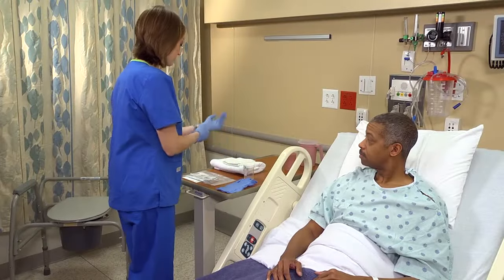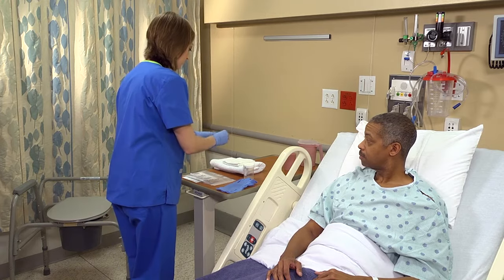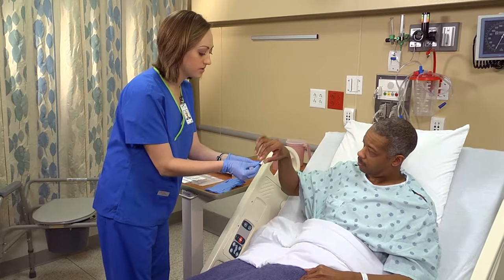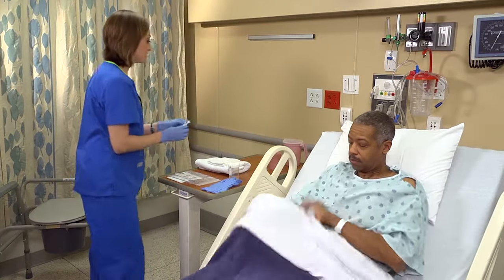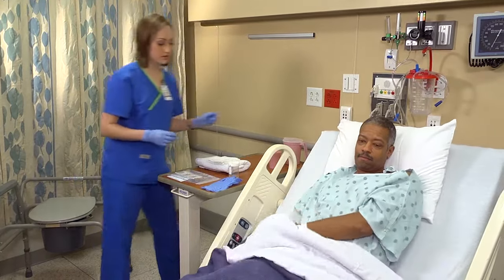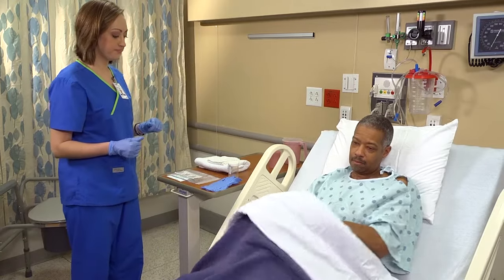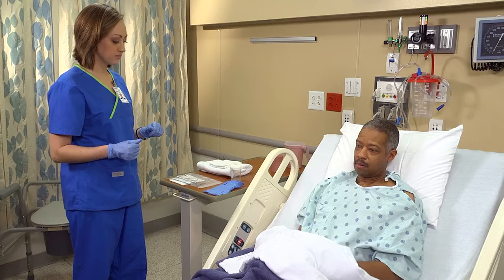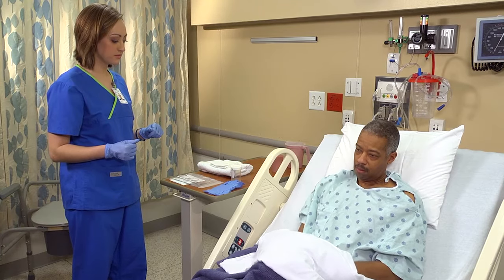Apply clean gloves. Give the patient a cleansing towelette or a towel, washcloth, and soap to cleanse his perineum, or help him to do so if necessary. If he's unable to get up from the bed, help him onto a bedpan to allow him to reach his perineum. Then remove and dispose of your gloves.